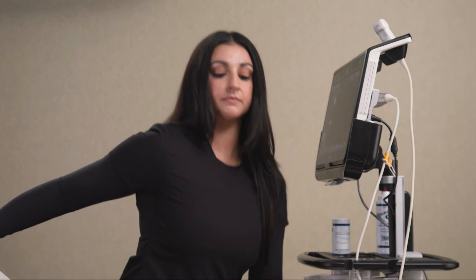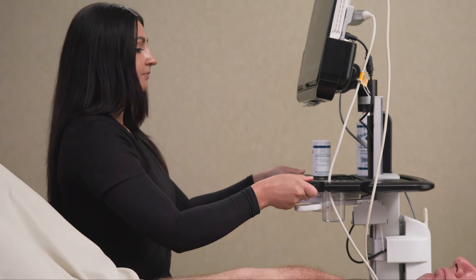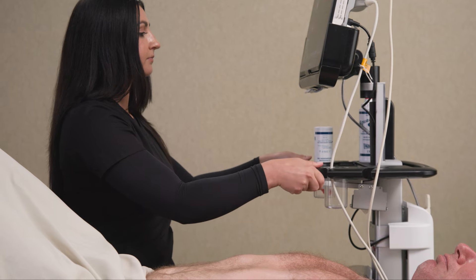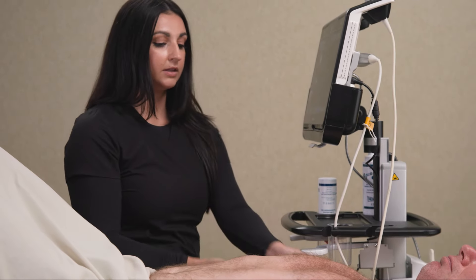First, you want to sit next to your patient on their right side. Bring the ultrasound system close enough to you so that you do not have to stretch or reach. Lower the system so that the screen is at eye level to prevent any neck strain.